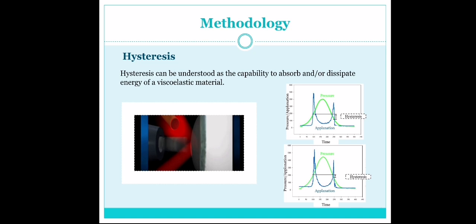In this graph, the curve with 2 peaks is the deformation produced by the pressure. The curve with a Gaussian shape is the pressure exerted. The difference between the point where the first peak intersects with pressure and the second peak intersects with pressure is the hysteresis value. This value tells us how the tissue has recovered against the pressure exerted. Keep in mind that the cornea is a viscoelastic tissue and takes time to recover. If we compare these two graphs, we can see how the one below has a lower hysteresis than the one above.